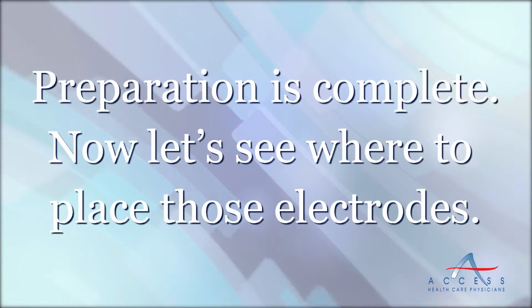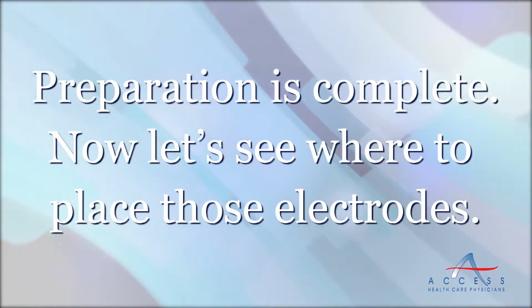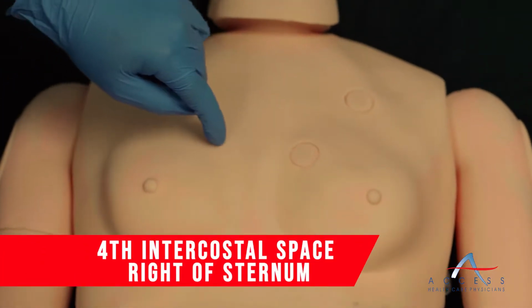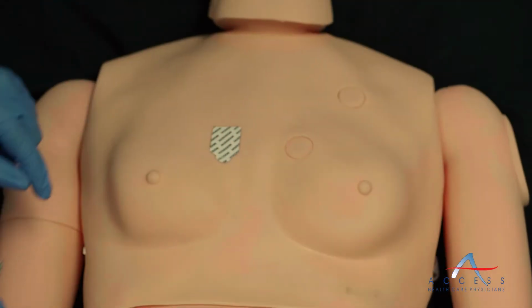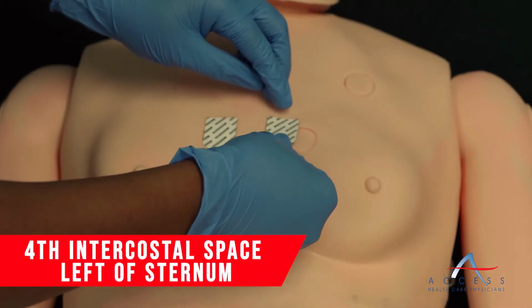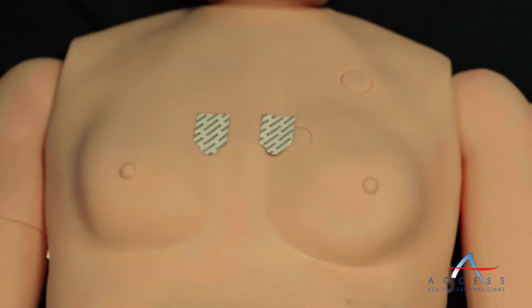Now that the patient has been properly prepared for the EKG, let us take a look at the chest electrodes and their placement. The V1 electrode should be placed on the 4th intercostal space to the right of the sternum, near the level of the armpit crease. The V2 electrode should be placed on the 4th intercostal space to the left of the sternum, near the same level of the armpit crease.